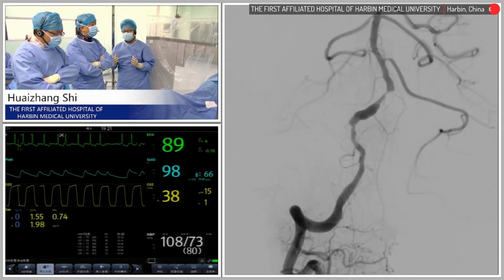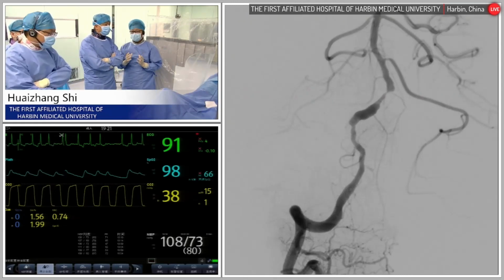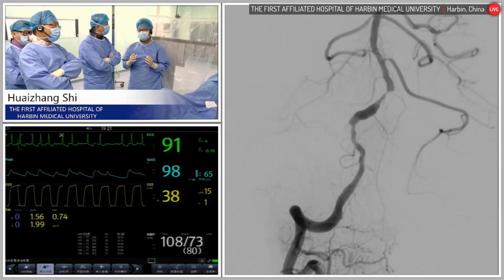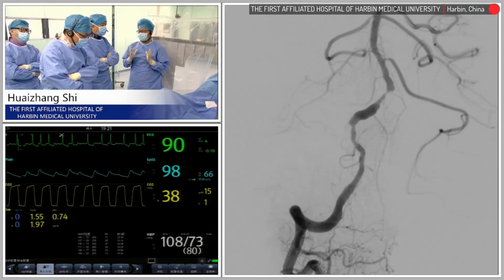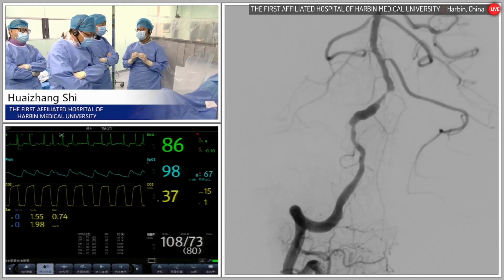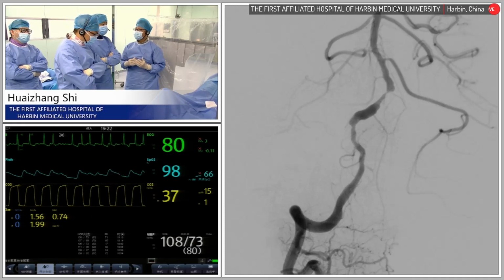Okay. Let me do the survey. Dr. Shi, I think today we have a very good case. It's different from the last case. Yes. Two weeks ago, we demonstrated the treatments of carotid stenosis and vertebral stenosis. But today's case is very different. The stenosis is in the intracranial part. So what's your strategy for this patient?